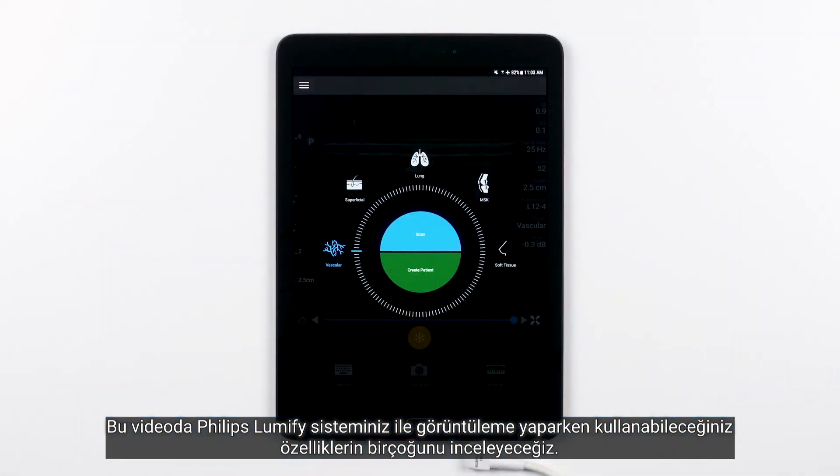In this video, we are going to go over many of the features available to you while you are scanning with your Philips Lumify system.